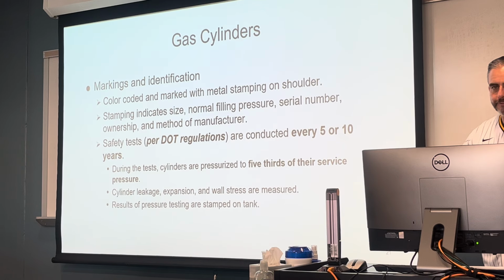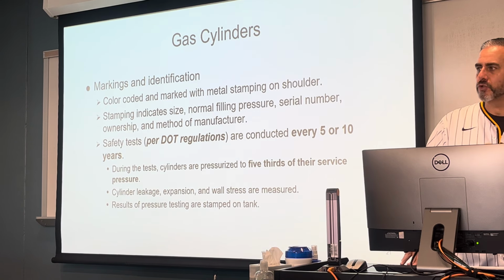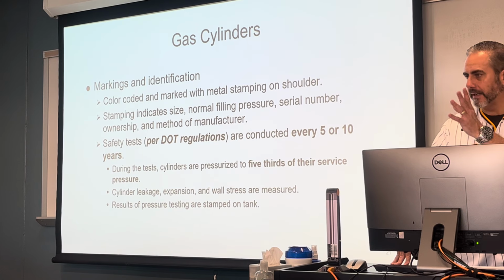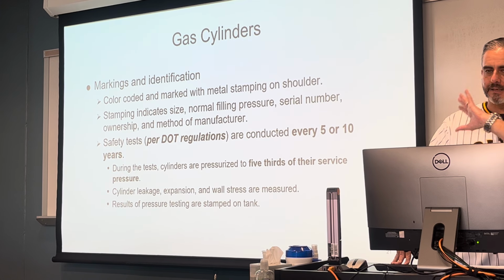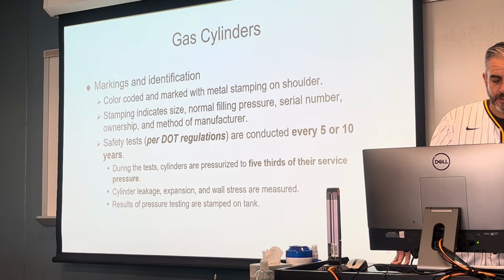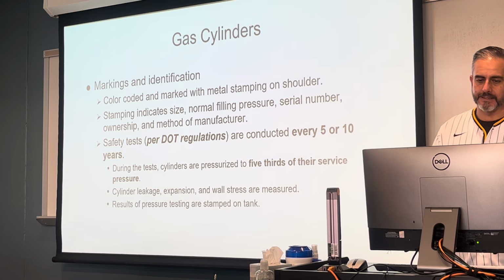During testing, they're looking for leakage. They're looking for expansion of the cylinder. Any stress on the walls. If they notice that, obviously they will pull that tank, dispose of that tank, and give us a fresh, brand new tank. The results of the testing are part of what's stamped on the tank each and every time it goes through testing.